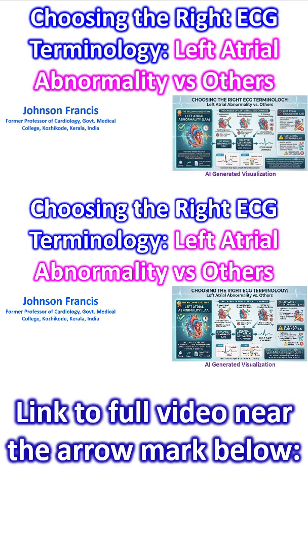The 2009 AHA/ACCF/HRS recommendations for the standardization and interpretation of the electrocardiogram explicitly favor "abnormality" over "enlargement," "hypertrophy," or "overload." Here is the clinical rationale behind why left atrial abnormality is a superior term.